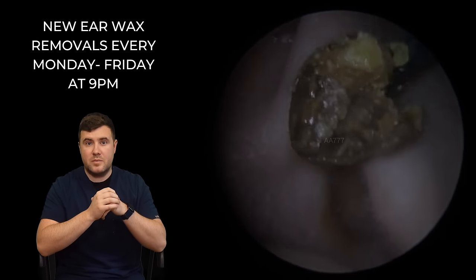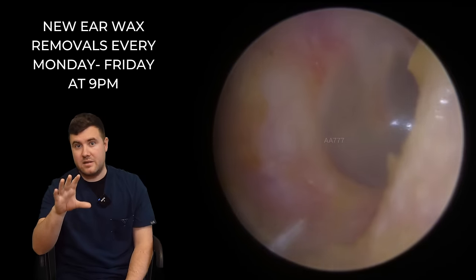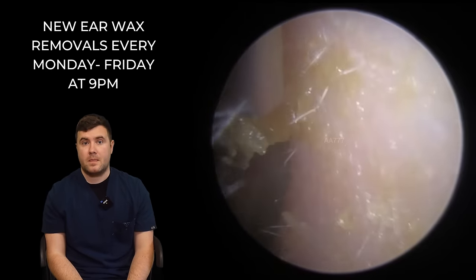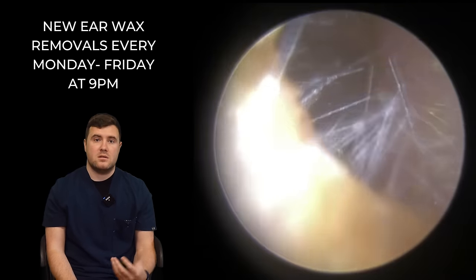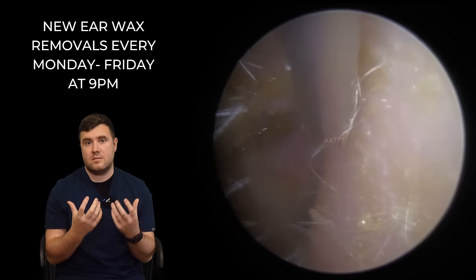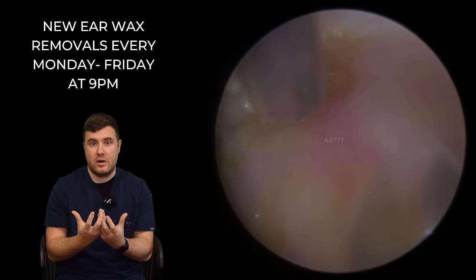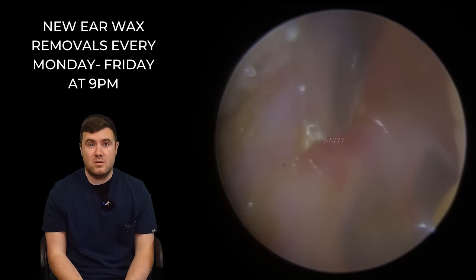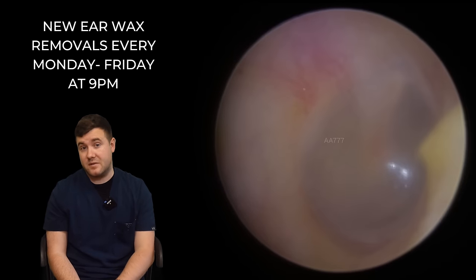So this plug has been removed. The patient is already hearing so much better. There we go — you can see the eardrum nice and clearly there. We are just going to nip in now with the fine end, which is the smaller suction tube, just to clear these little bits away. The fine end is a lot nicer in regards to sound. The standard-sized Zonor tube sounds a lot louder than the strength — it's quite a weak suction that we use, but it sounds a lot stronger. So the fine end is nice to just keep the noise down slightly, and it also helps us to be a bit more precise. Eardrum looking nice and healthy, patient already hearing so much better, and relieved — which is nice.